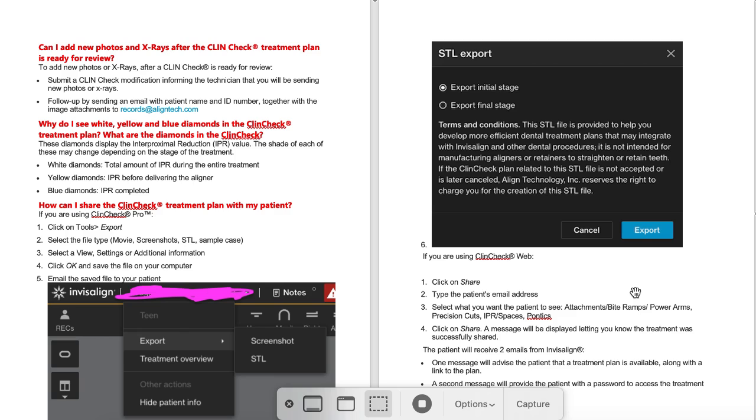So basically, in a nutshell, this first review covered the newest ClinCheck IPR staging, including IPR quantification, cumulative IPR, how to share a ClinCheck, and how to export an STL from the initial or final stage of your ClinCheck. Stay tuned — I have a little bit more coming shortly.